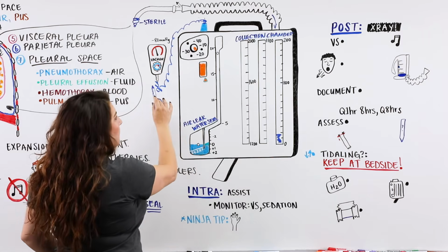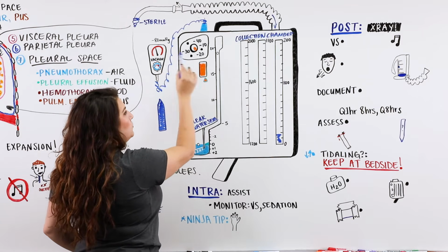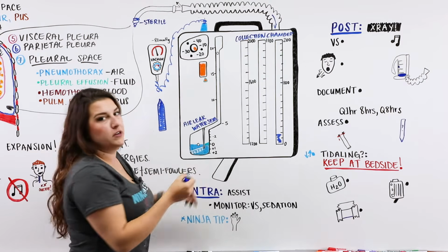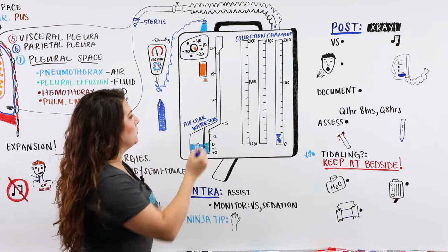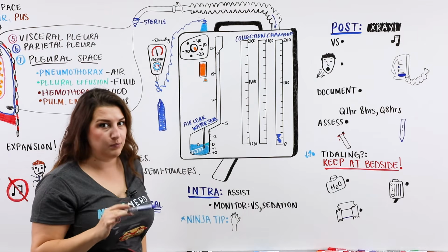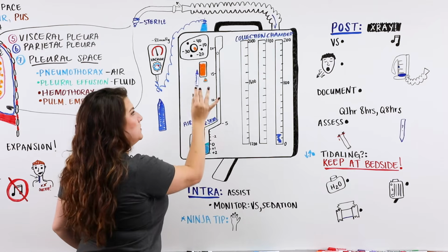When you do that, this bellows will pop out. This is only for if you're connecting to wall suction will the bellows pop out. If there's no wall suction, nothing to worry about here, but it's just this little orange indicator to make sure it's coming out here to this little arrow, and that's going to make sure that this whole negative and positive air pressure within this body is normal, okay? So everything's working properly. It's just an indicator for us.